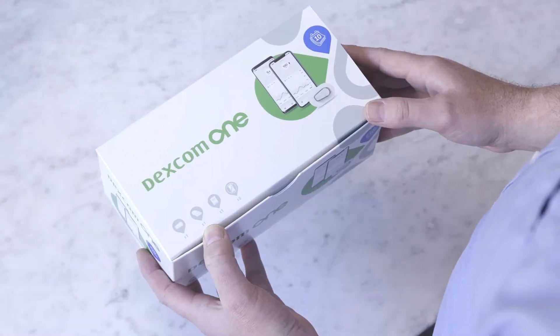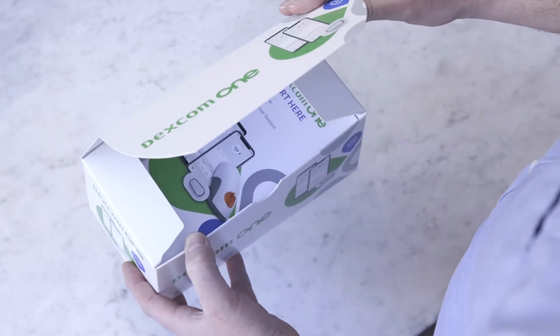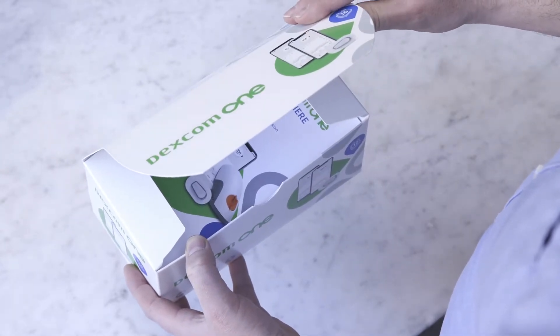Dexcom One is a continuous glucose monitoring tool for managing diabetes and we are going to show you how straightforward it is to get started.